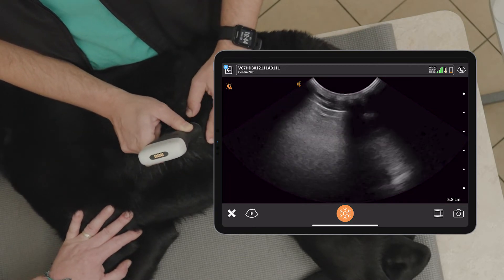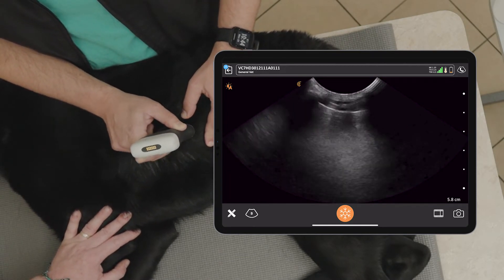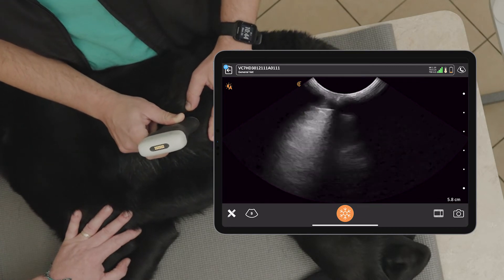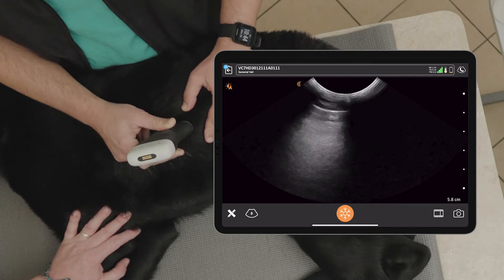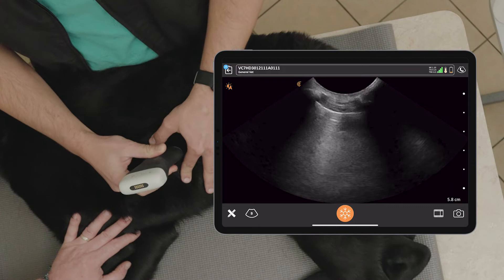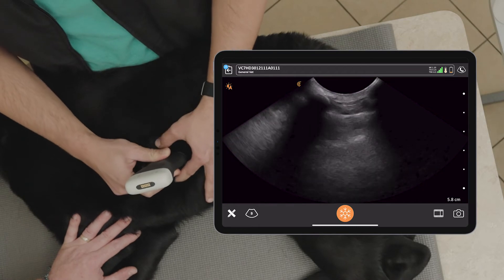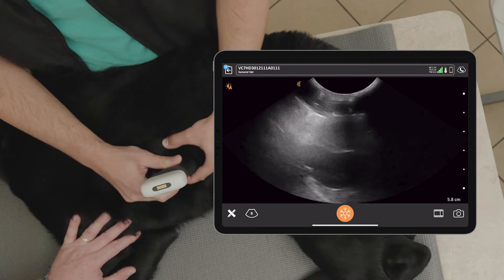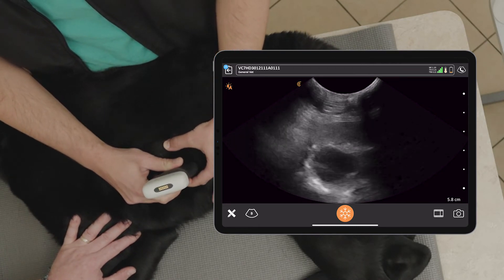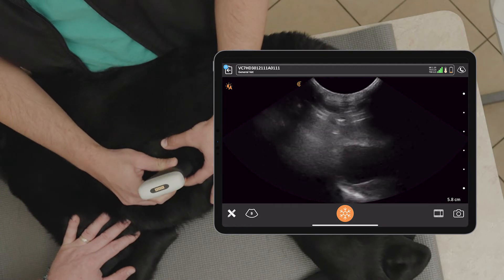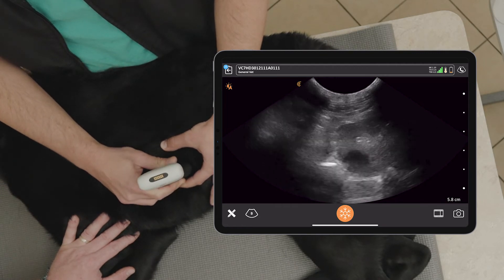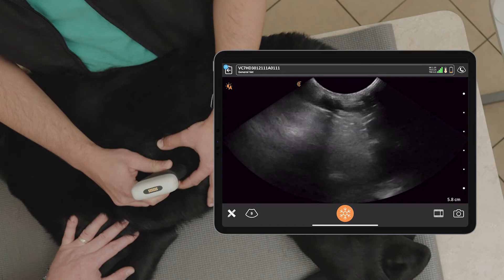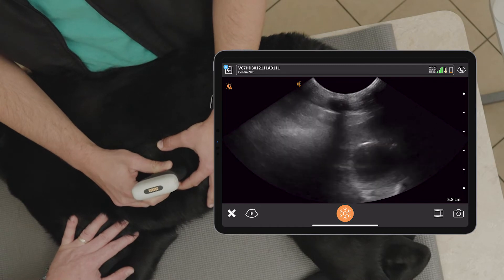We keep coming caudal — there's that curtain sign again. So we've done the dorsal and middle third of the lung surface looking for pathology. We're now going to drop down ventrally until we get essentially that pericardiodiaphragmatic window, where we've got the heart and the diaphragm in the same window. At this site we can keep the probe perpendicular and scan the lungs for pathology.